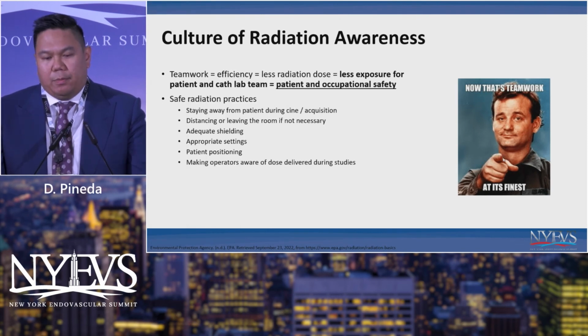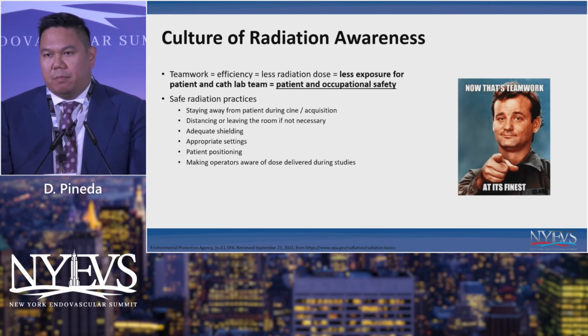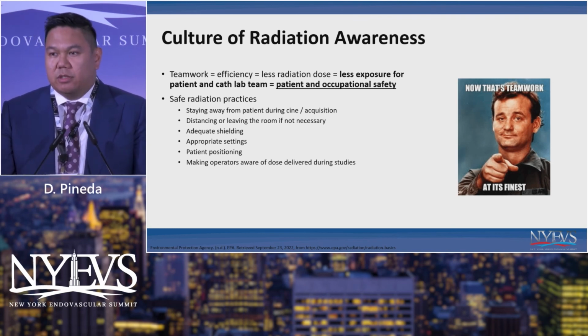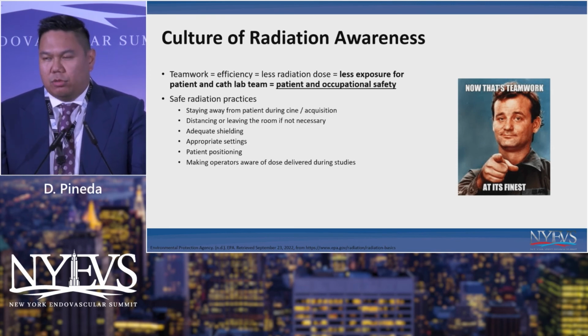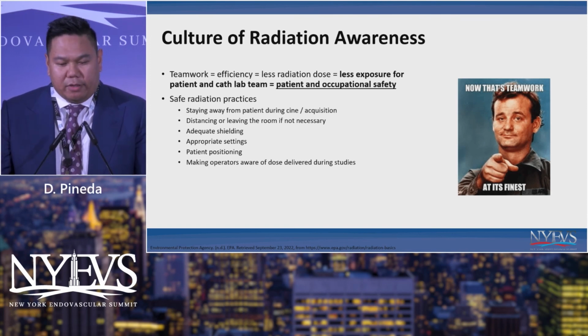So in summary, I think it's very important to create a culture of radiation awareness. As nurses and techs, you may not be at the table, but you do have a big impact on the overall outcome of the procedure just by anticipating what they need, being familiar with the procedure and understanding what the interventionalist needs and what their next steps will be. Instead of letting the operator struggle and struggle, you already have the next equipment there. That, believe it or not, changes their mind quickly and lowers their threshold to trying another modality.